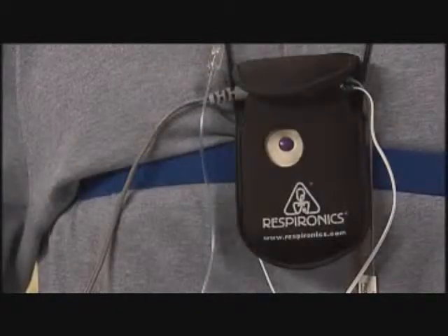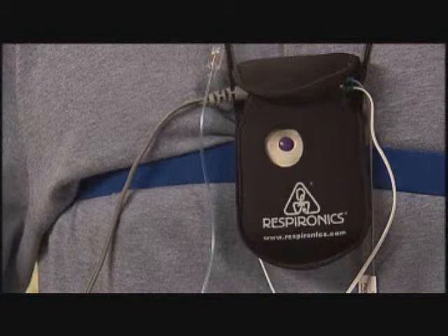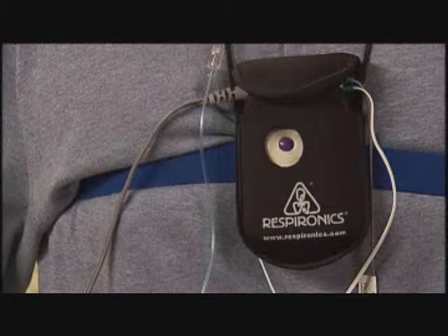Notice the purple button located on the front of the StarDust2. Pressing this button will let your provider know when you are ready for sleep and if you are up during the night. Press the purple button. You can now go to sleep.